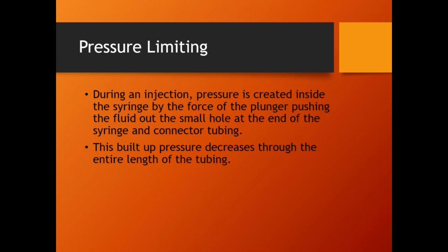These systems are set up to be able to shoot the protocols at the pressure limits the system has been set up to. For whatever reason, and I don't know the answer to this, I've been teaching this exact model for 14 years now. The syringes are rated at 400 psi. The catheters are rated at in excess of 400 psi. IV needles are rated at over 1,000 psi.